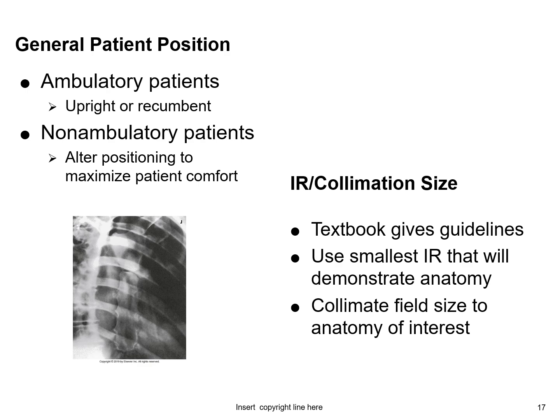Now, time's probably not going to allow for me to demonstrate both, but I do have a trauma lecture coming up for RAD Procedures 3, and we're going to go back and revisit a lot of what we did upright. I'm going to show you how you would pull that off if your patient was AP supine on a backboard and you couldn't roll them or move them. I'll show you how to do a lot of the trauma projections during the trauma unit in our trauma lab.